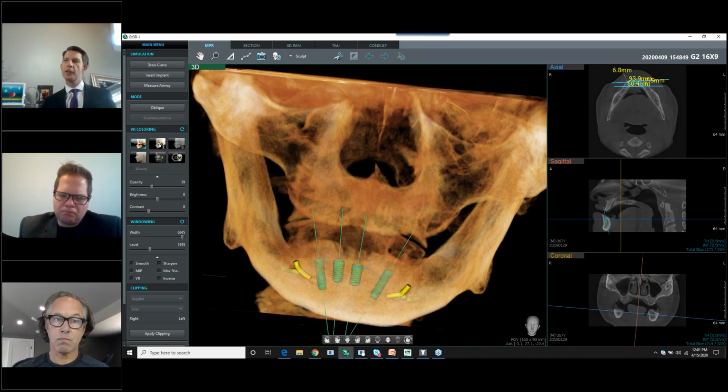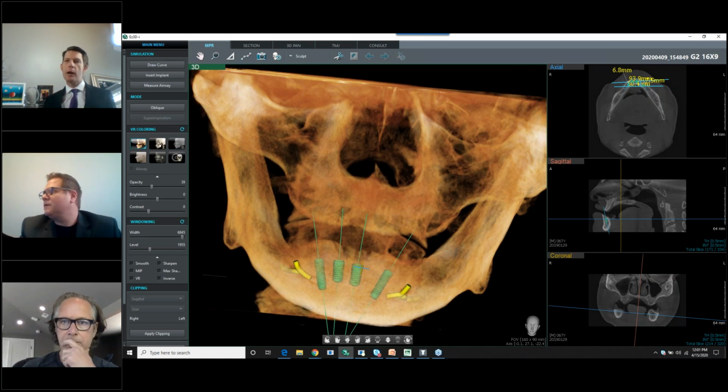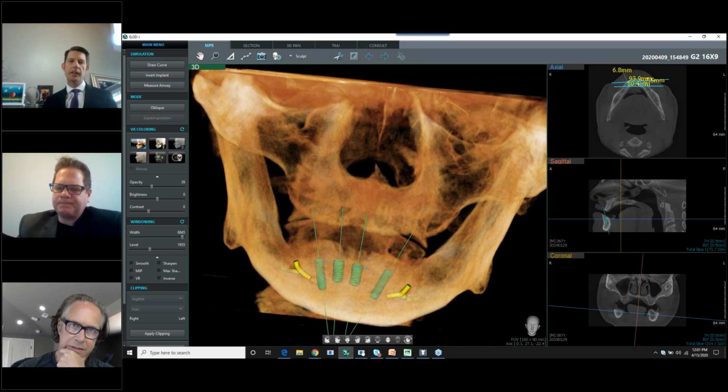Right. Really looking forward to your presentation next week on the 22nd, leading into that and talking a little bit more than just, hey, we're using software. How are we making that connection with the patient is the main thing there. So, yeah, I know that you had brought up some stuff about the guided surgery thing.